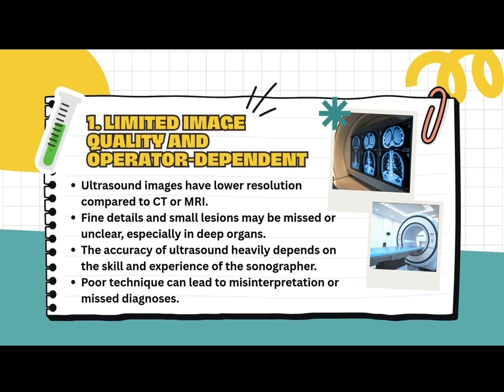In addition, ultrasound is highly operator dependent. This means the quality and accuracy of the image depend on the skill, experience, and technique of the sonographer. Incorrect probe placement or settings may lead to missed findings or misdiagnosis.